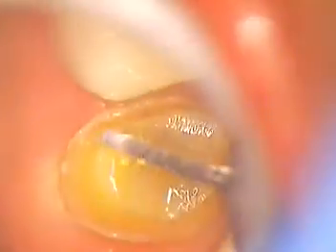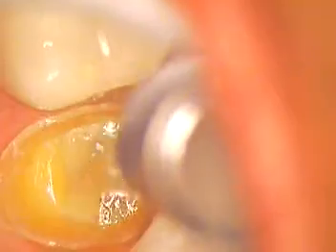Air on the mirror. A little water on the mirror. A little air. All right. All right, so now what I'm going to do is go all the way around and just marginate. I'm going to use a regular chamfer burr for that. Regular chamfer burr. Here it is.